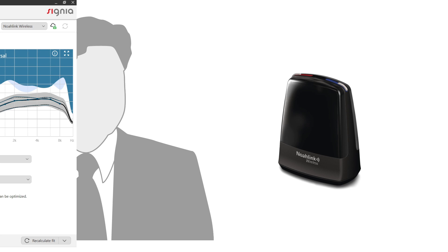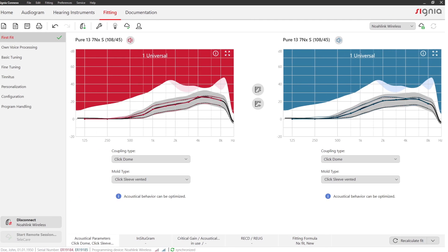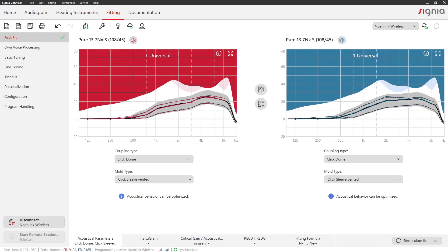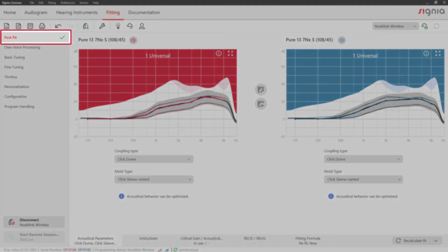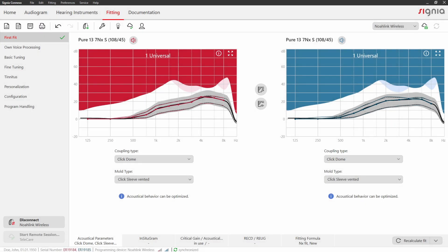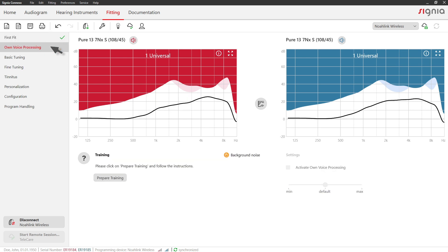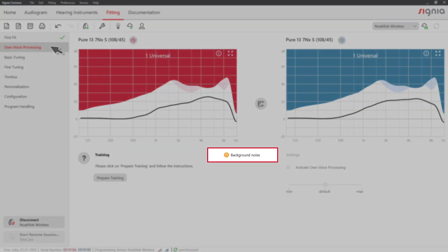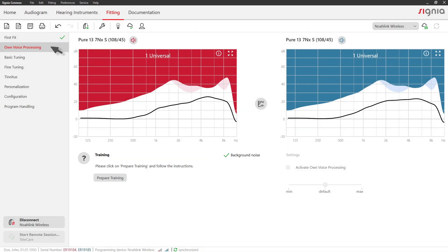First, perform your first fit with your client. Now enter own voice processing right below the first fit tab. A green check mark shows you whether the room is sufficiently quiet to carry out the training. Now click on prepare training.